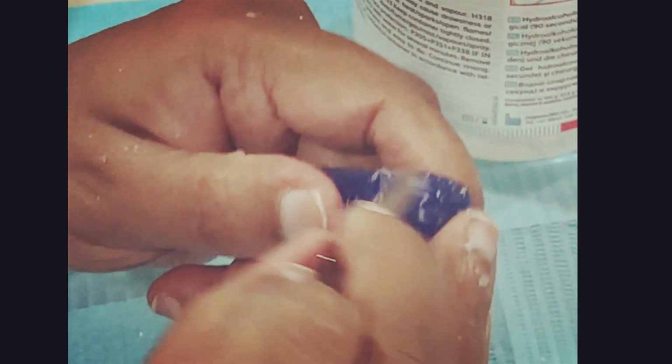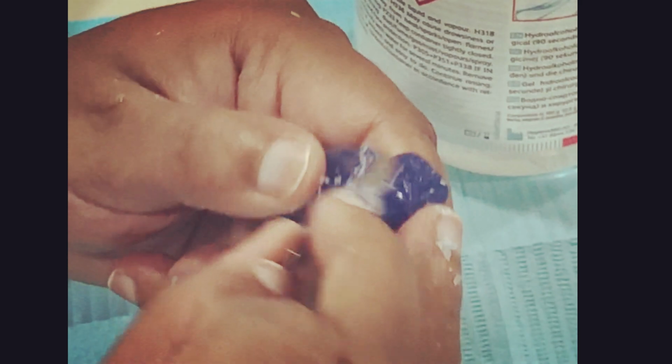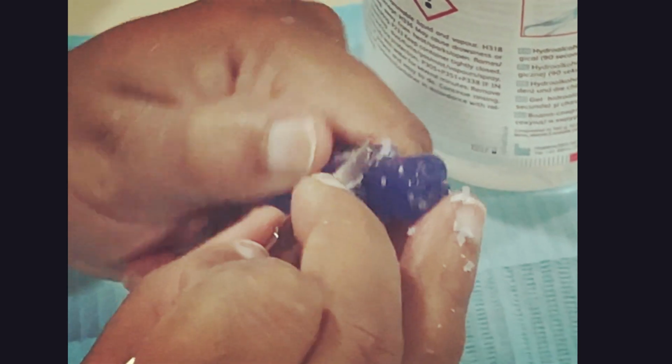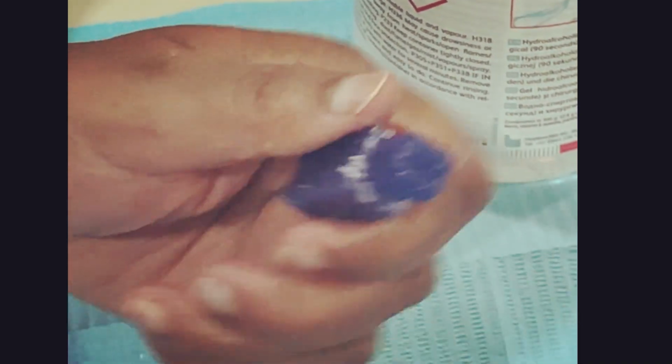Don't put too much pressure whenever you're doing this step, okay? Because you've finished your crown, you don't want to over carve it, okay? So it's just to make it all come together.